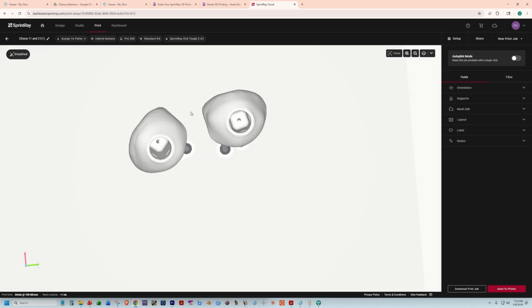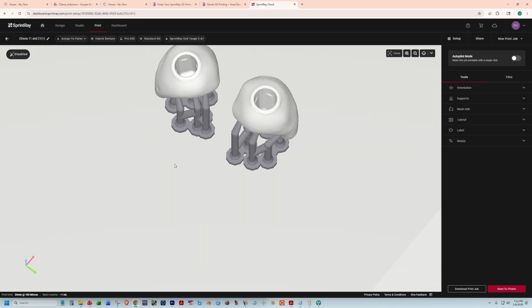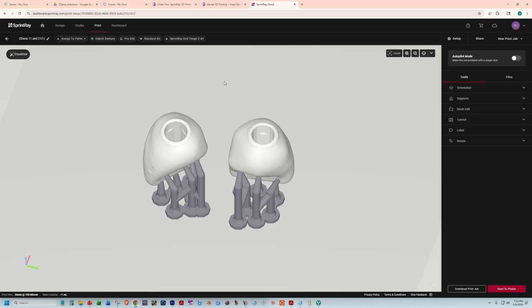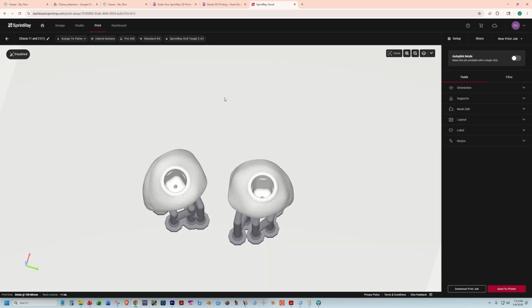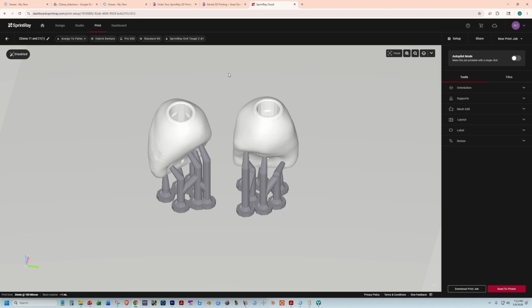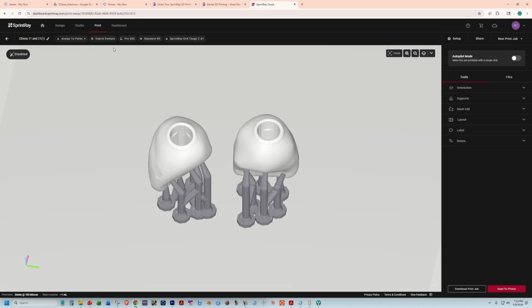Now, if you look closely at the intaglio of these temporary crowns, you can see the geometry that resembles and in fact matches the geometry of the angled abutments that we saw a moment ago, the angled abutments that we used for these 2 implants.